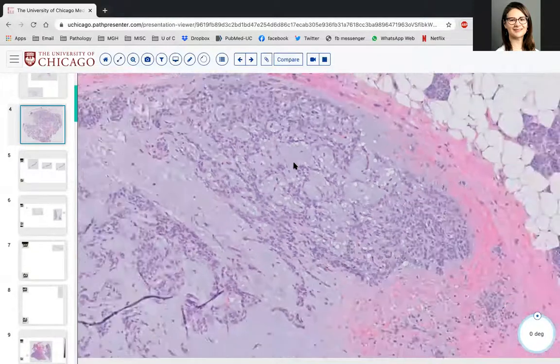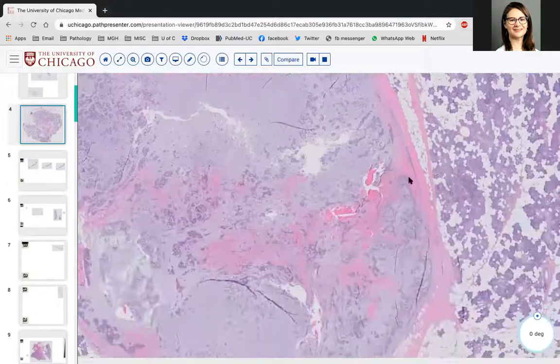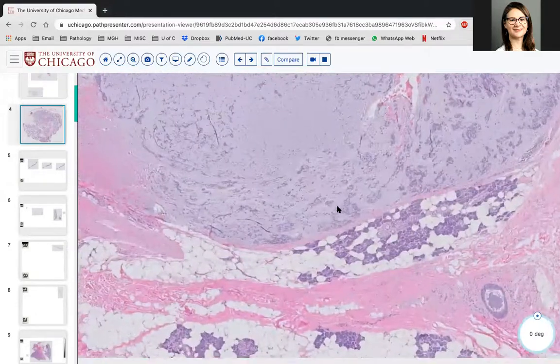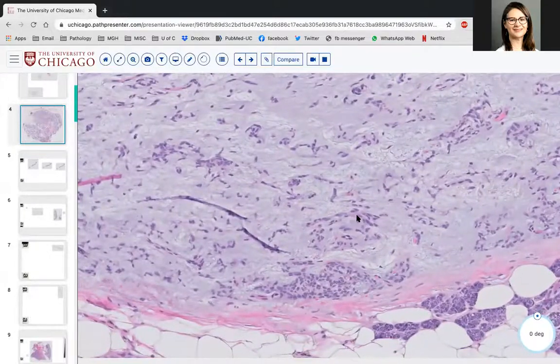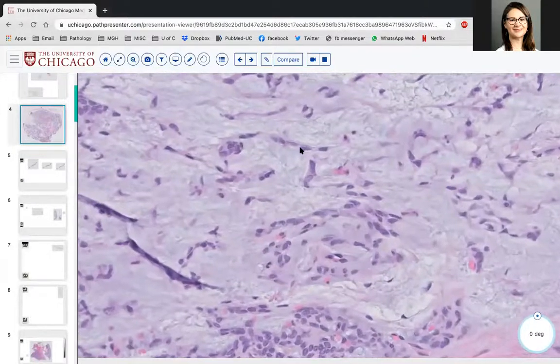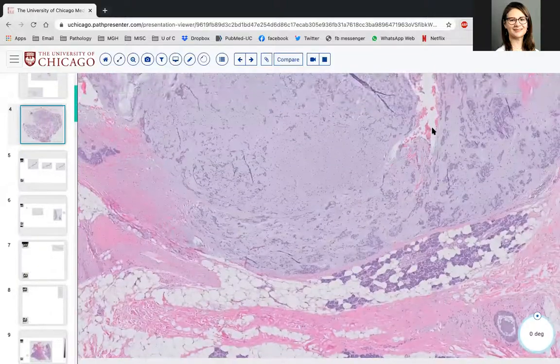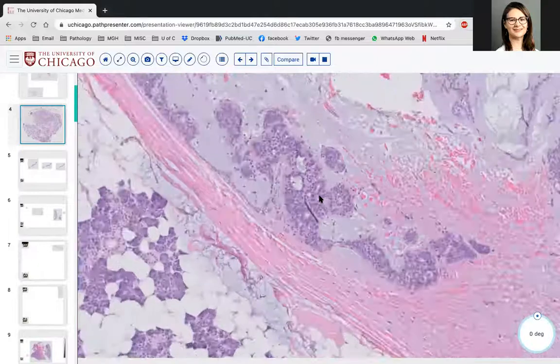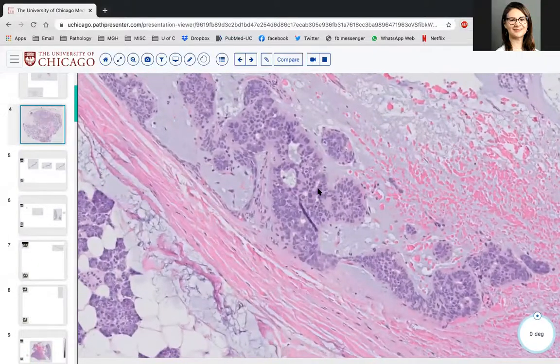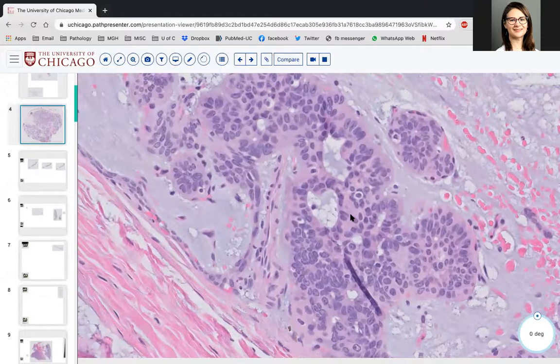Right. So we don't think about this diagnosis too much in salivary gland, because generally when you find a myoepithelial cell-rich tumor with myxoid stroma, you're going to see a true duct somewhere. True myoepithelial pure tumors of salivary gland are, in my opinion, extremely rare and perhaps non-existent unless they're myoepithelial carcinomas.